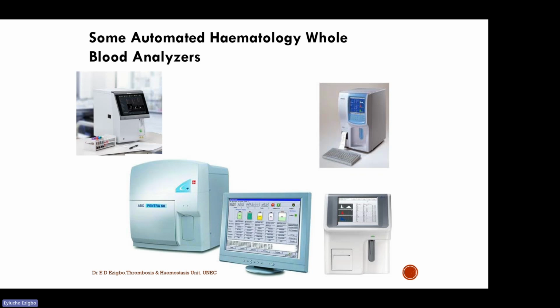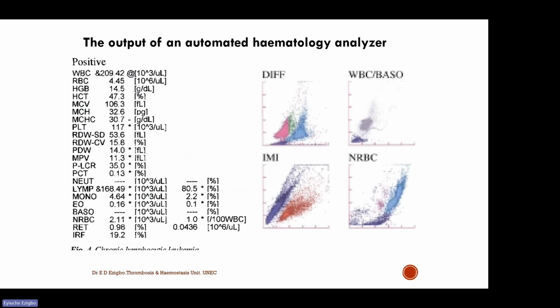They differentiate the white blood cells into 3 populations, while the 5-part differential differentiates the 5 parts of the white blood cell: neutrophil, lymphocyte, monocyte, basophil, eosinophil. It's able to characterize all of them and identify them. That's what gave it the name 5-part. When you look at this diagram, it's showing us the result output from an automated analyzer. You can see the whole process that is taken manually to count WBC or red blood cells, the whole process that is taking us hours.